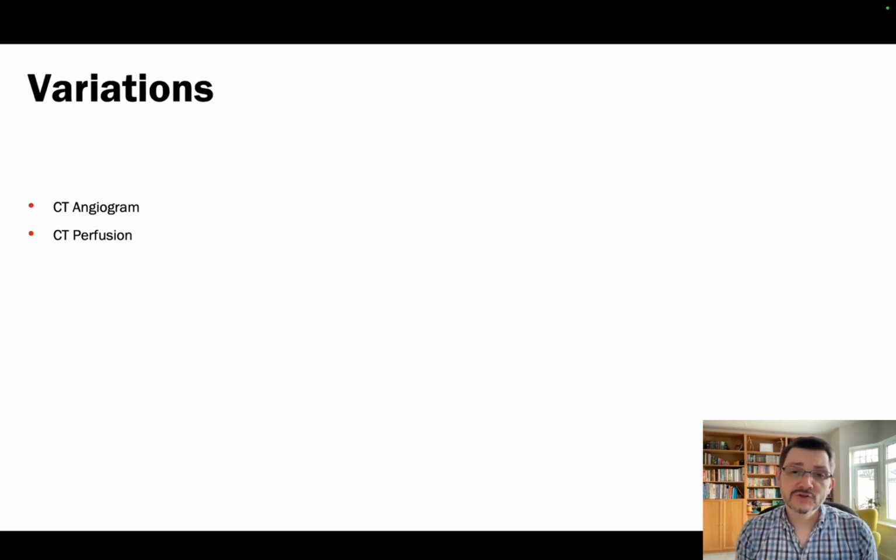I've got some variations on screen here, so basically using the same technology, the same principles, but not the same interpretation of the images, same difficult approach to the way you look at them. We'll cover those in another talk in a different subsection, so don't worry, we'll come back to those briefly, and again that will just be a fly through, so don't worry too much about that.